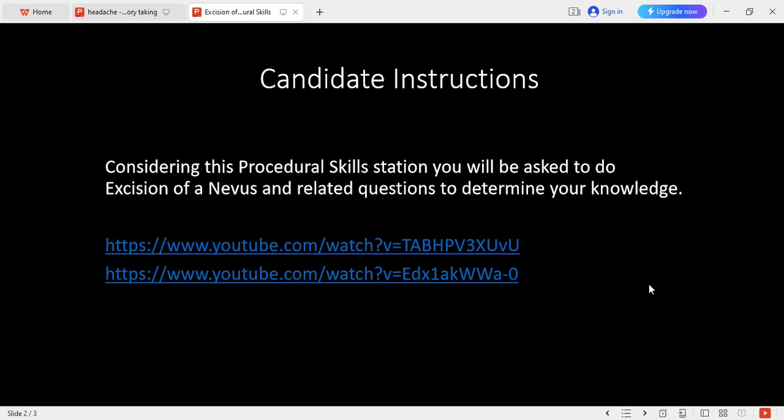Kindly tell me how would you prepare your area? I will first of all gather all the instruments. First I will need the scalpel, number 10 blade, surgical gloves, sterile gown and drapes, and mask.